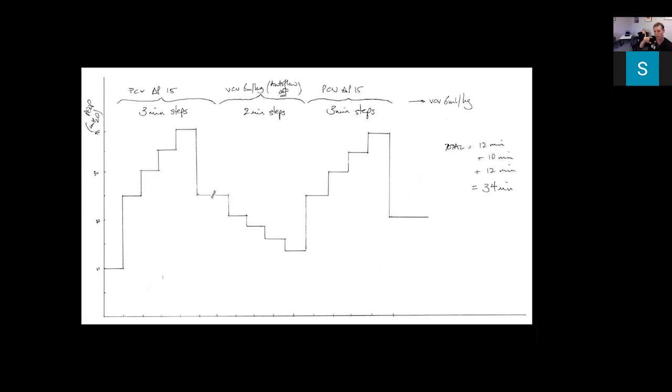I think you've got to fix your pressure high. So I actually try and use my driving pressure now and look at volumes instead, because doing it the other way, you can cause high pressures. So please, that is something I've learned through error. It doesn't take 34 minutes anymore. I think you can do this much, much faster. You just have to wait for 6 cycles of the breath. So I have changed it a little bit since this.